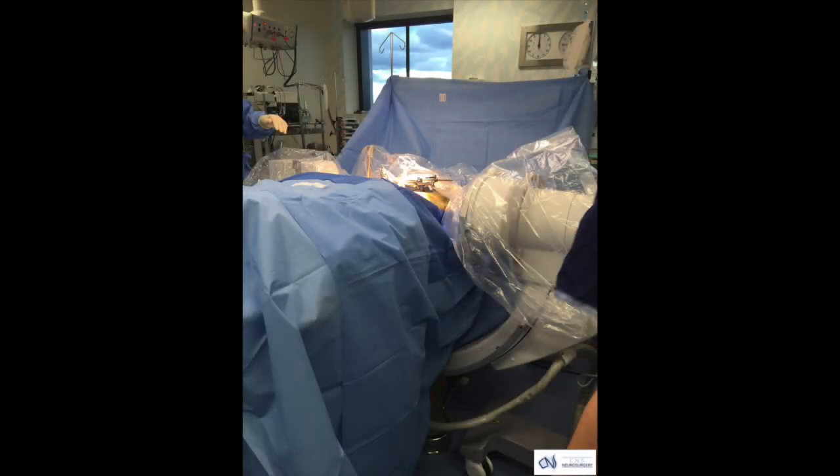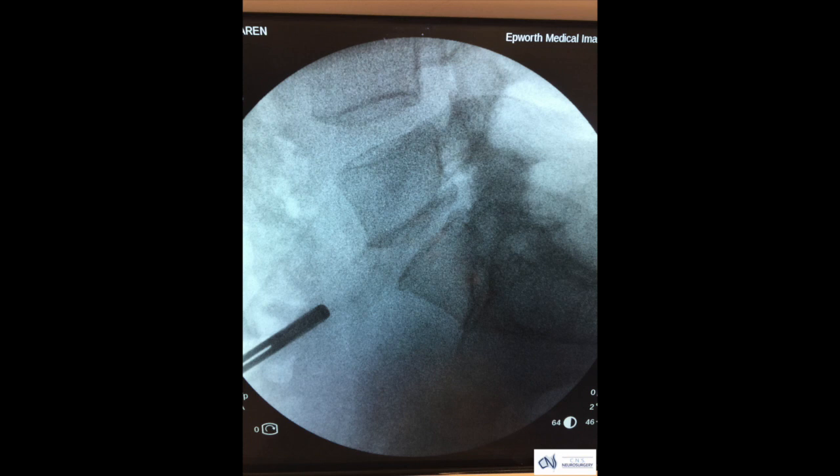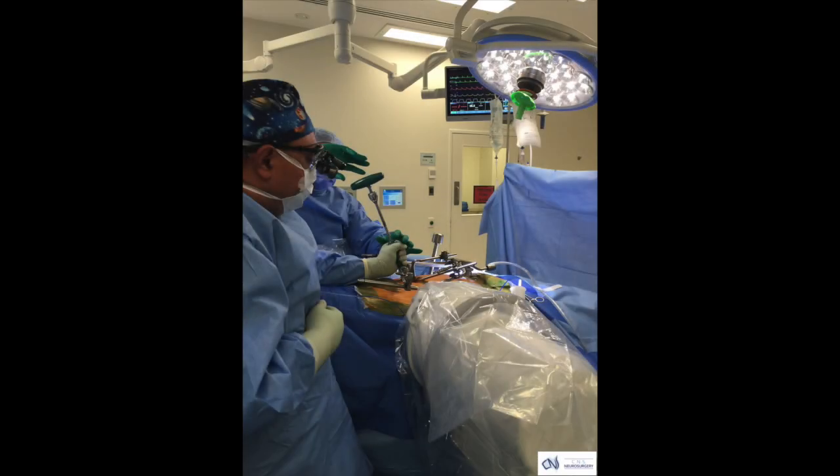When I place these devices we do this under x-ray guidance. This is an x-ray showing localisation of the disc space that is going to be surgically targeted. This is an intraoperative photograph of the device being placed via a minimally invasive small incision in the front lower part of the abdomen.